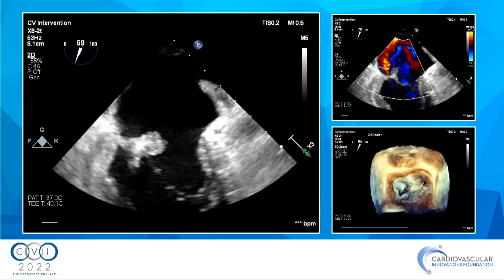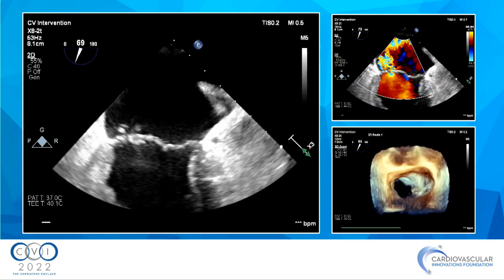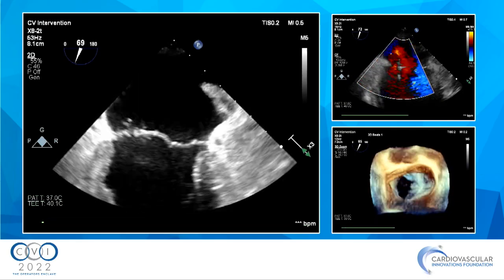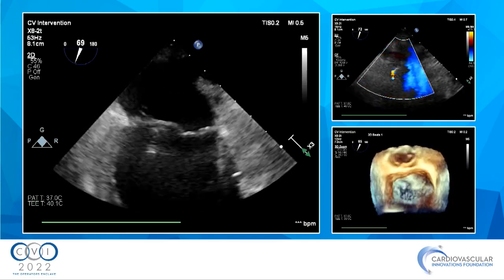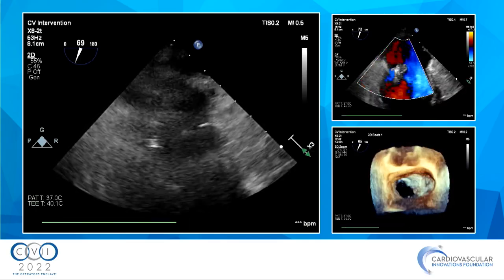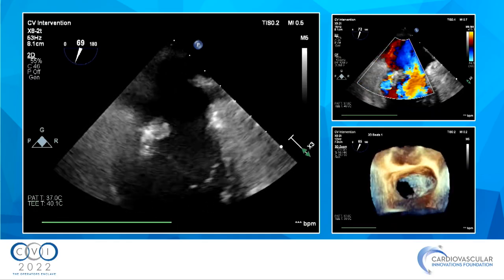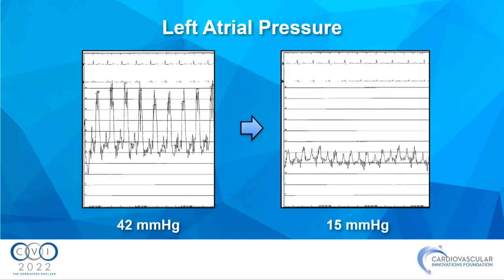In the top right, you can see there's still a lot of MR. And in the bottom right, you can see there's not a whole lot of space to go medial. But I was prepared to, because I said, we'll put this in, we're going to keep trying. But I had serious concerns about the pap muscle being on the LA side and everything being up there where I couldn't grab. So then I swapped things out, and then look.